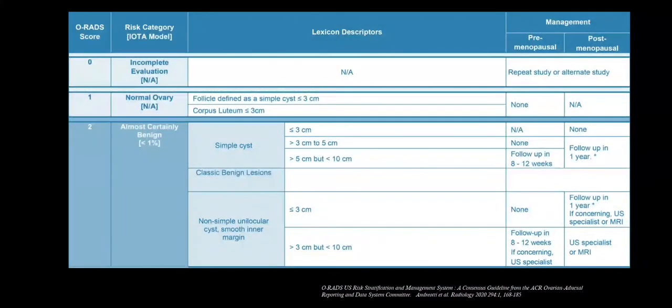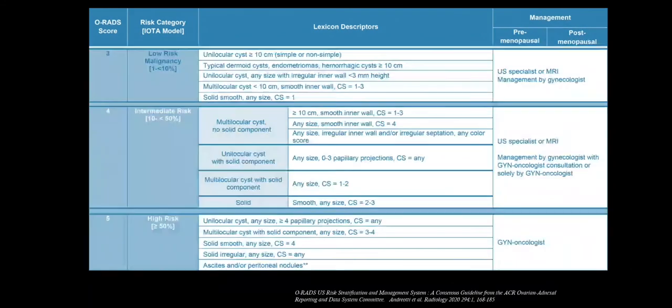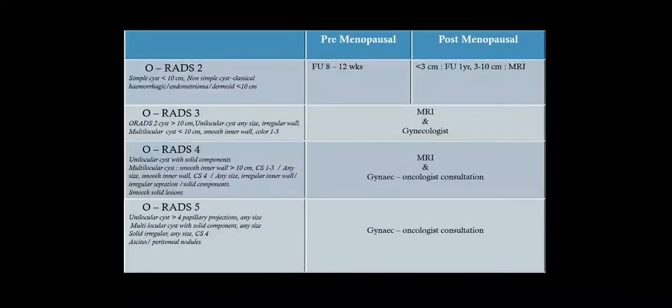Now this is a description that I have taken from the journals that I had quoted earlier, but these descriptions are pretty crowded. They have the lexicon descriptors, and also they have the management that we would suggest in premenopausal and in postmenopausal women. We have already gone through the descriptors, so I wouldn't be repeating it. I've made it really short in this tabular column, and I'm just talking about the management here.